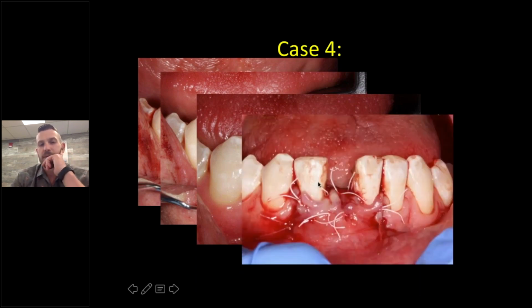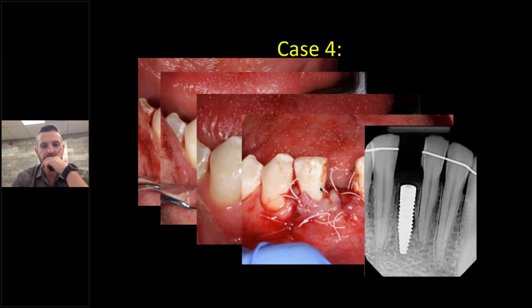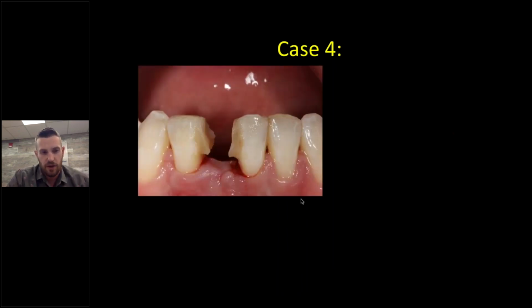And then in this case, the implant wasn't as stable as I would have liked, so I obtained primary closure on it. And then this is with everything sutured closed. And again, I was not a big fan of placing this type of provisional restoration on this patient, but he was insistent he did not want anything removable. So we splinted a tooth in place, and I did not do this part either. He came back to me this way, and he had been losing the tooth a couple of times, and I said we should do a removable, but he did not want to. So he continued to put it in place, and again, that's ugly.